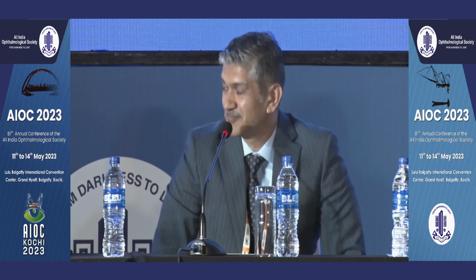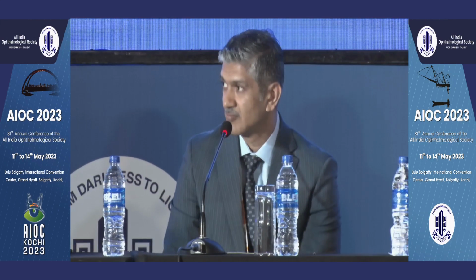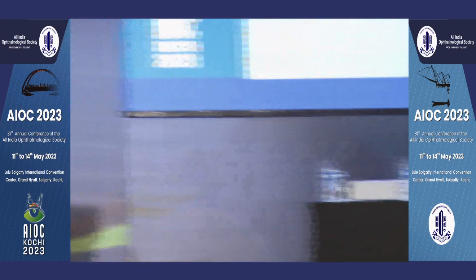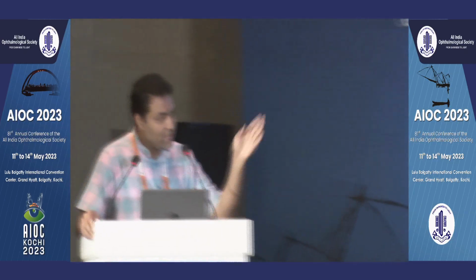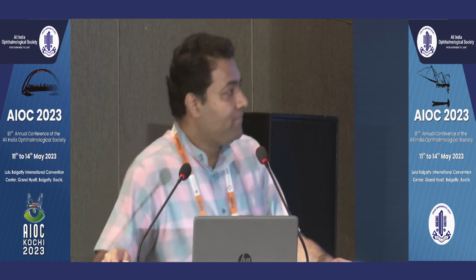So probably the risk of ectasia in countries like ours, where we are treating a very young population, would be much higher. So that's where devices like this can provide us insight, where we are actually able to image the collagen. And like I said, your excellent work on Smile Extra, when we started doing this, where we did a randomization, it exactly proves what you have written in your discussion, that it biomechanically changes, and this is a proof. So whatever we say, we need proof, and the proof is when you see this image, like I showed, those orientations completely change.